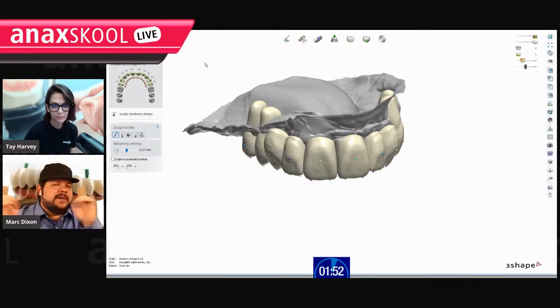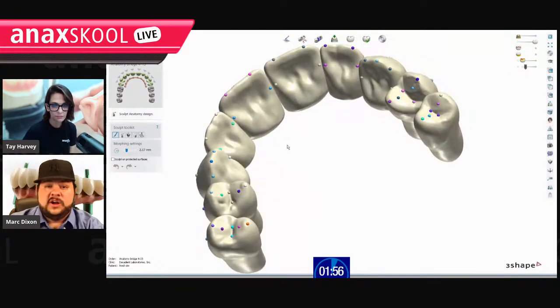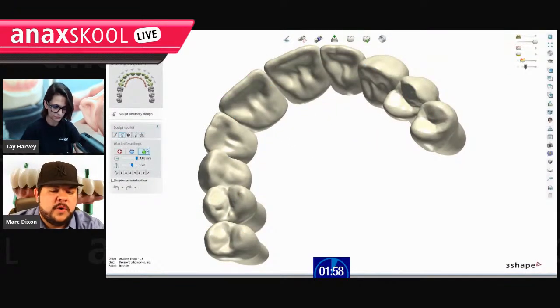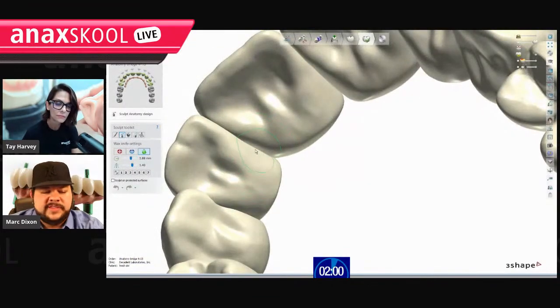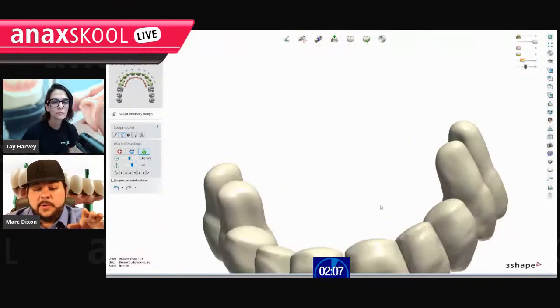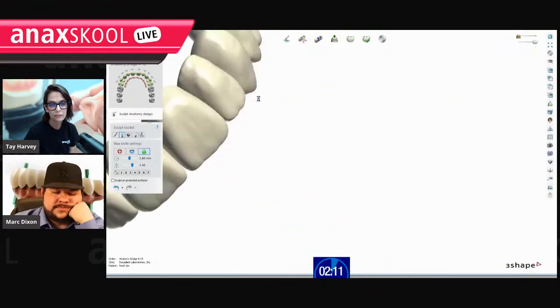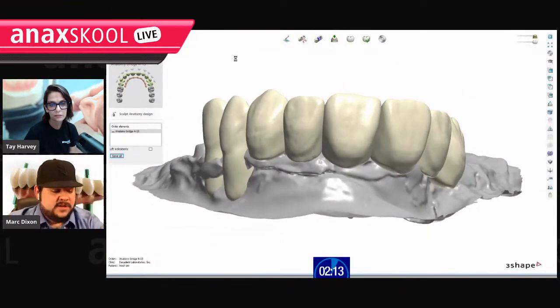Okay. Now we don't have individual teeth. Now we have one big hunk of mesh, right? So that's when we go in here, and usually when we're actually doing things, we'll go in here with a smooth tool and just sort of do stuff like this so we can get a nice robust frame. But we're done. Now everything's one piece. That's the finalized step, right? Okay. So we hit next. We're done. That's it. So I'm going to hit the timer.